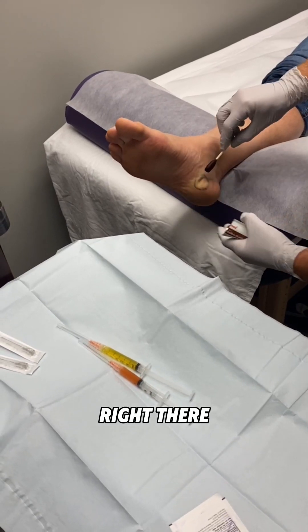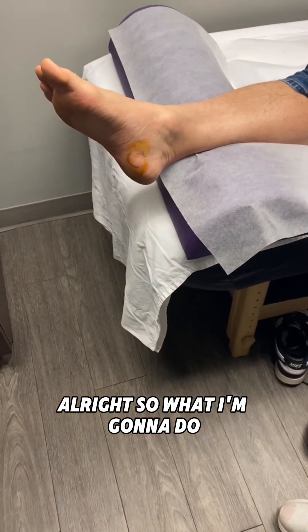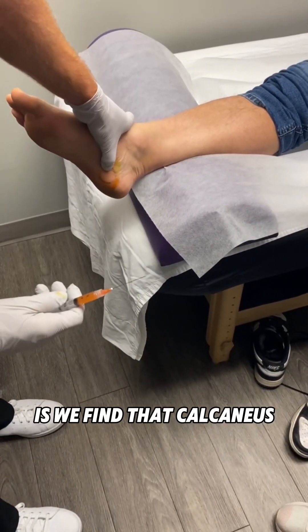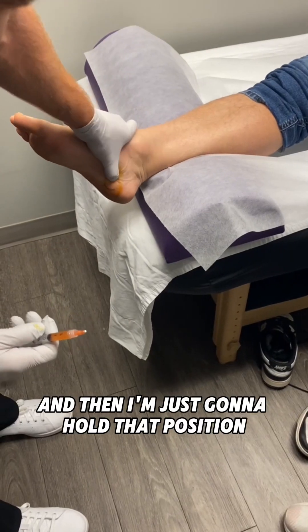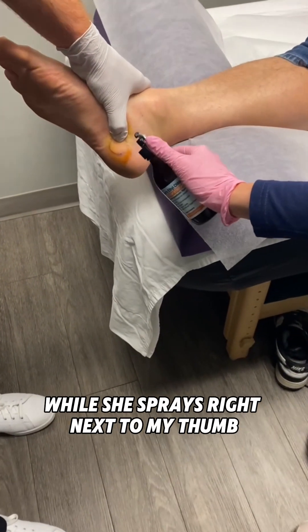So it's kind of right there. What I'm going to do is find the calcaneus and then hold that position while she sprays right next to my thumb.